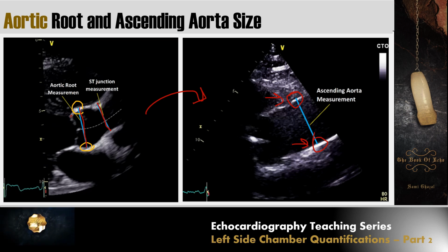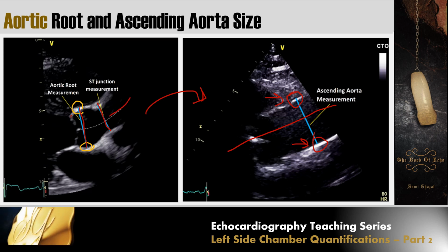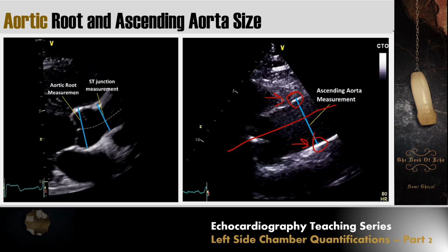Okay, and not only that, the measurement has to be perpendicular to the long axis of the aorta, here and there. It has to be perpendicular. We cannot have an angulated or tilted measurement. Measurement like this is not accepted. Measurement like this is not accepted.